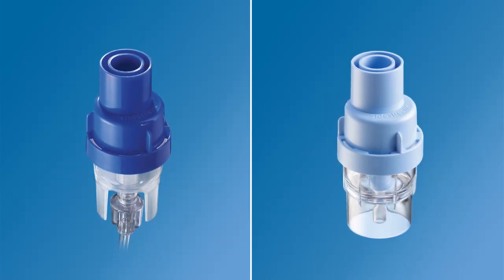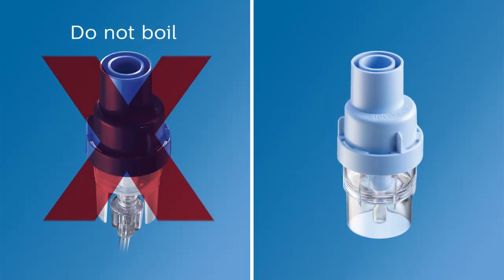If you have a dark blue Sidestream nebuliser, it's disposable and should not be boiled. We recommend that you replace your Sidestream according to your instructions for use.